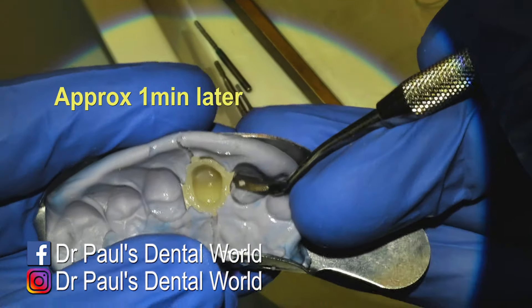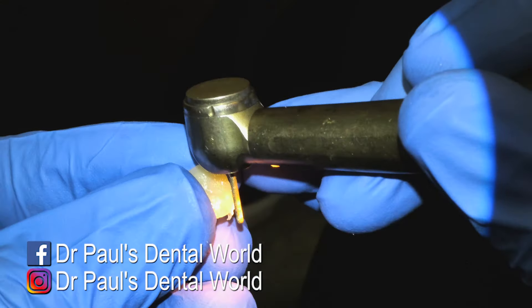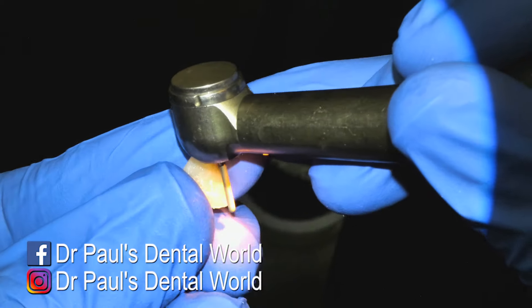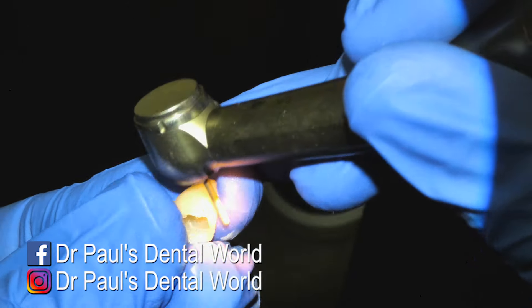And then at that point, I'll take it out with my flat plastic. At this point here, it's hard enough that you can now start removing the excess. So basically I'm just removing the extra little bits that shouldn't be there, just to get it all nice and smooth. Often you have to do a little bit around where those channels were and then along the margins.